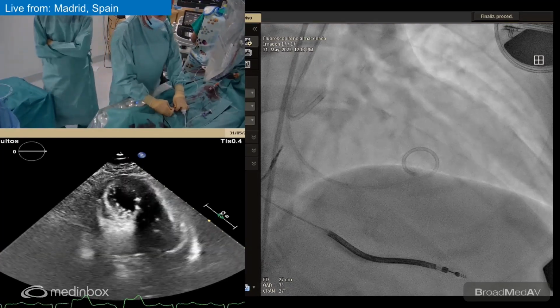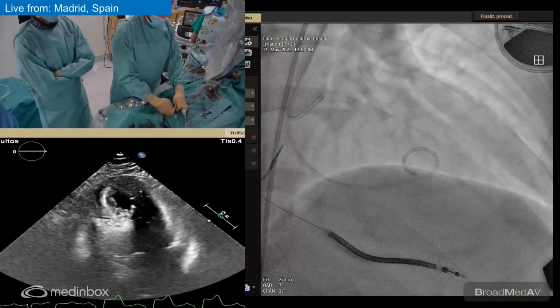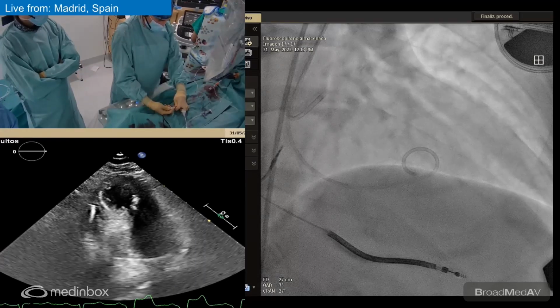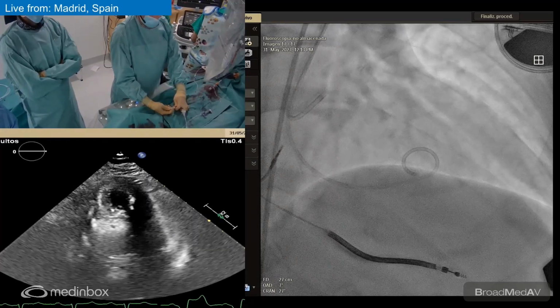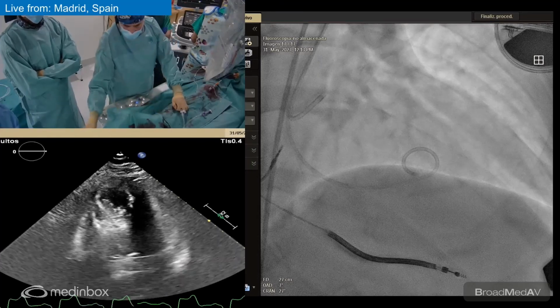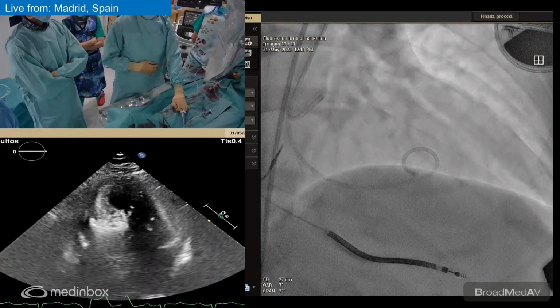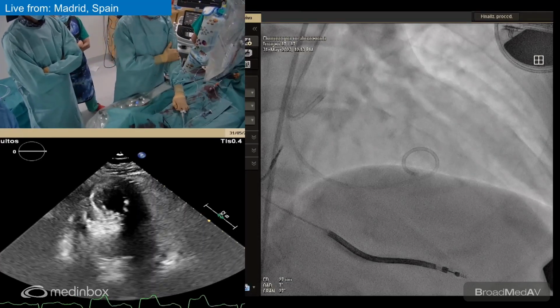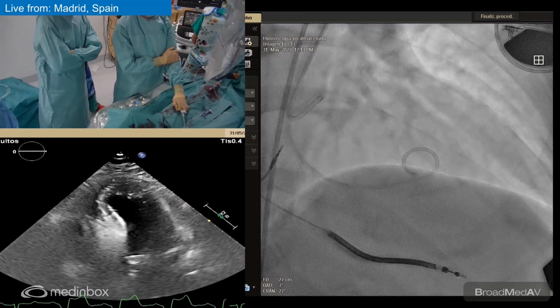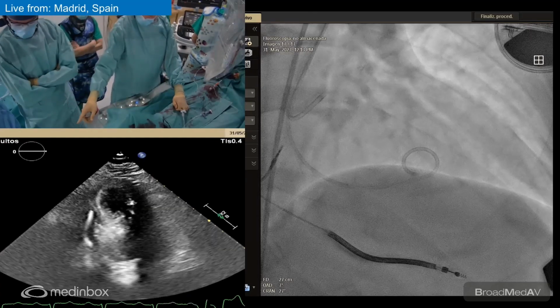Some colleagues do this marking with Sonovue or other echo contrasts, but the problem is that this kind of contrast is retained inside the ventricle more time than the gelafunin, and the echo is always white. And if you fail choosing firstly the good septal, you are blinded all the procedure. So I think it's a good site, no? Good place, yes. It looks okay to me.